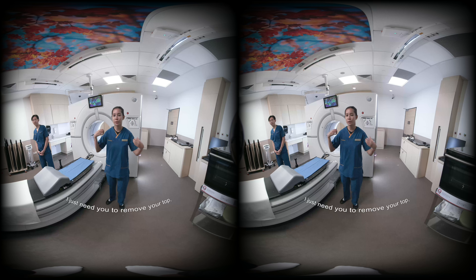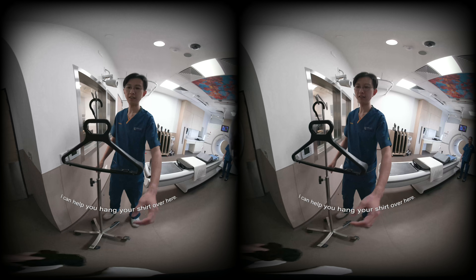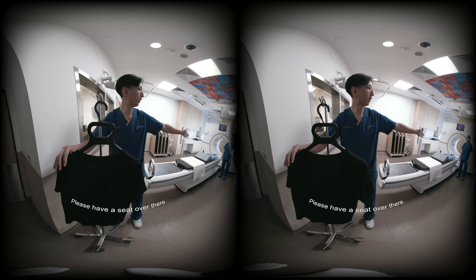I just need you to remove your top, so if you can just remove it over here. Okay, help you hang your shirt over here. Please have a seat over there.